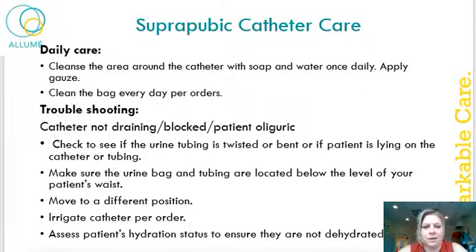Daily care of a suprapubic catheter: again, you're going to cleanse the area around the catheter with soap and water once daily and as needed. Apply gauze. You're going to clean the bag every day per orders.